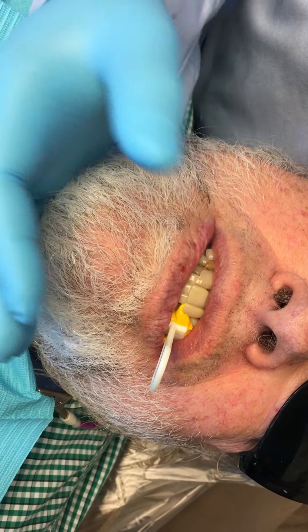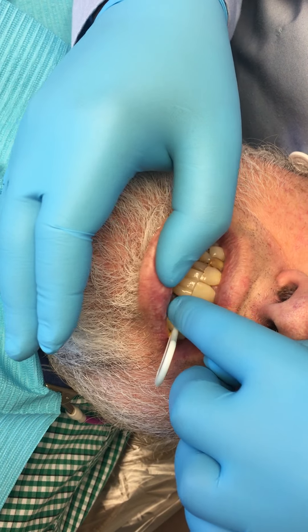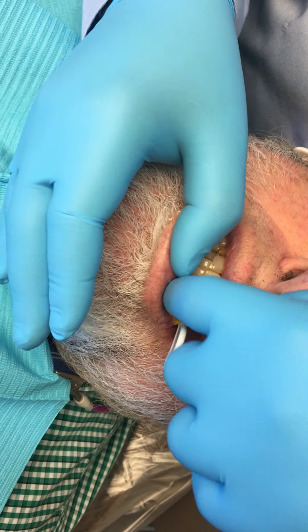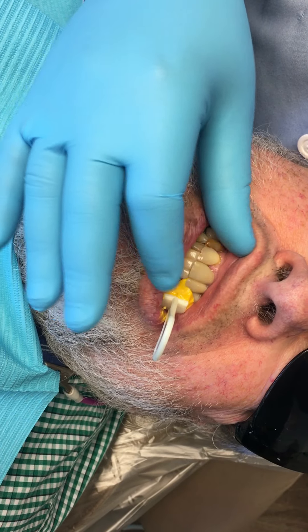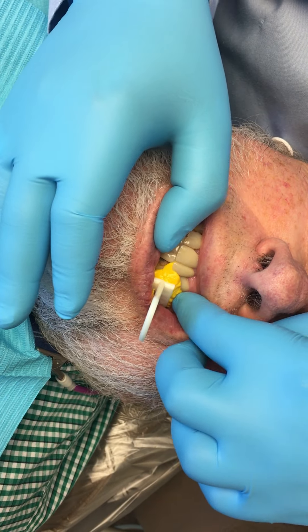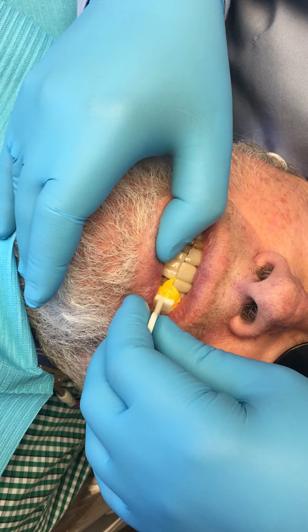Almost there. Almost. Okay, and open for me — open.